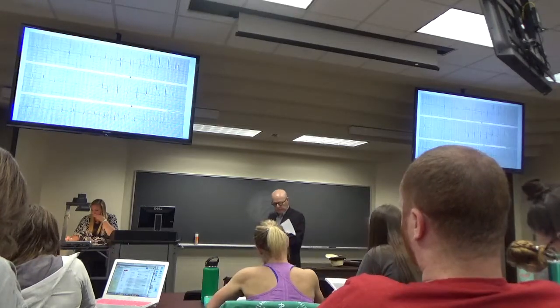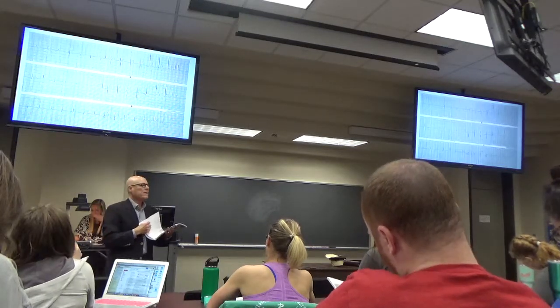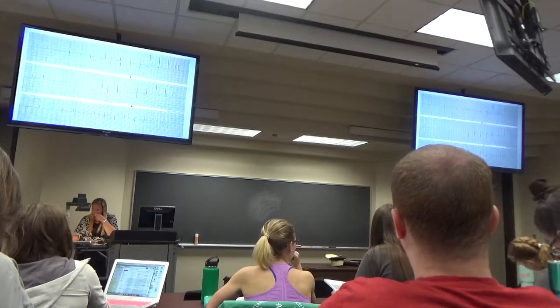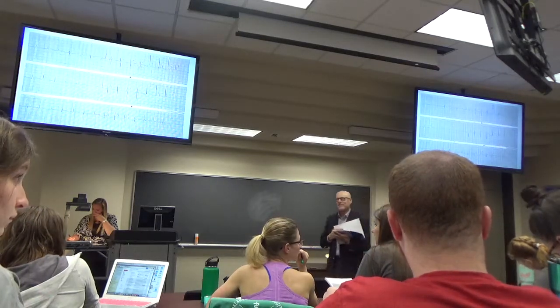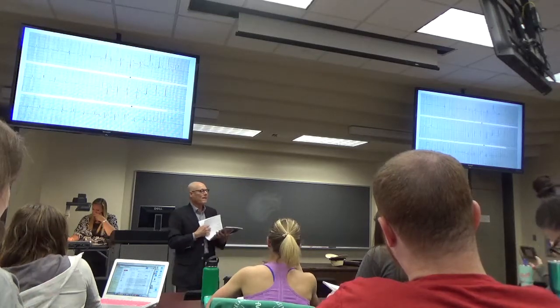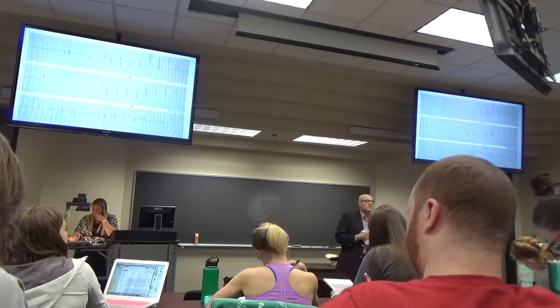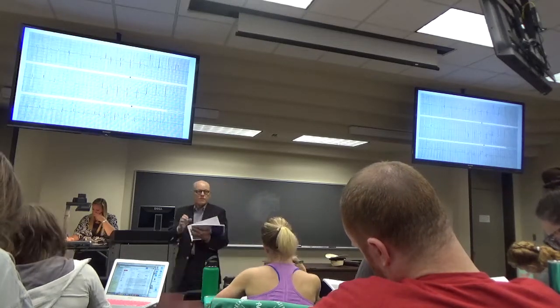These are pretty peaked. What is the number one cause of peaking of the T waves? Hyperkalemia? No. Jacob says ischemia peaks the T waves. I said that, that they peak right before they flip. That's what he said. He's the only person I've ever seen say that. I've never read it in a book. But that might be what's going on here. There's some ischemic heart disease in inferior leads, and the T waves are peaked. Okay? 47?